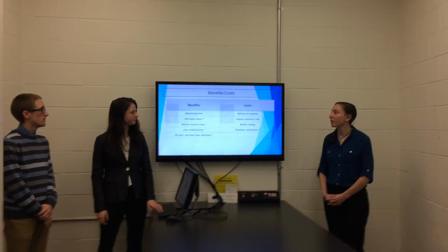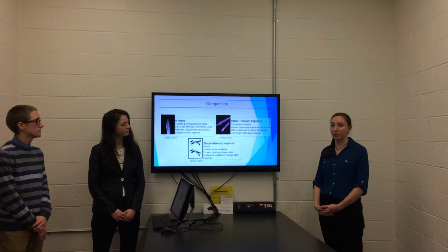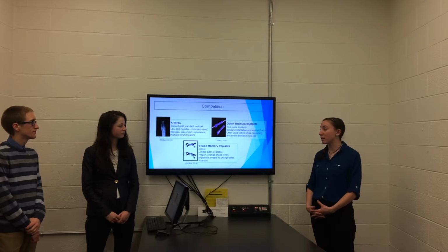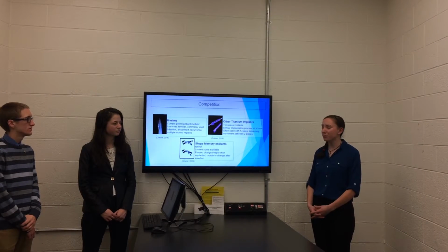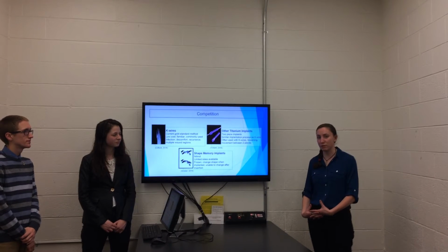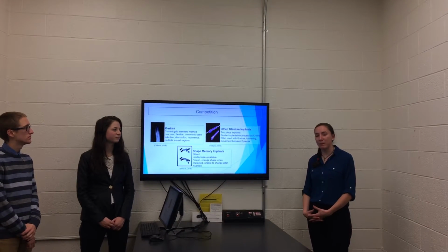So some of the competition in this field are the K-wires, which are the current gold standard, as mentioned before. These are low cost and familiar to surgeons because they are most commonly used, but they do cause percutaneous infection, extra discomfort for the patient, recurrence of the hammertoe deformity, and have multiple surgical sites, so they have multiple wounds to heal. Additionally, there are other titanium implants on the market.